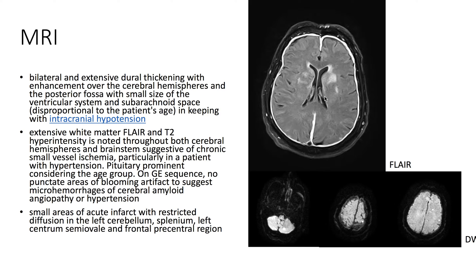There's also a small ventricular system and subarachnoid space. There are extensive white matter FLAIR hyperintensities noted throughout both cerebral hemispheres and brainstem, suggestive of chronic small vessel ischemia, particularly in a patient with hypertension.